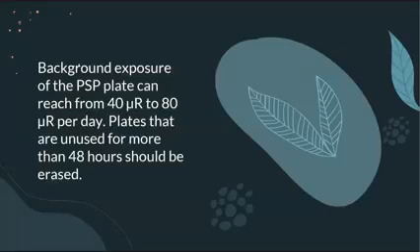So, background exposure of the PSP plate can reach from 40 microroentgen to 80 microroentgen per day. Plates that are unused more than 48 hours should be erased. So, dapat yung proper na practice is to, before mag-start ng X-ray, you have to erase first yung contents of the imaging plate, no matter how long it has been in the storage.